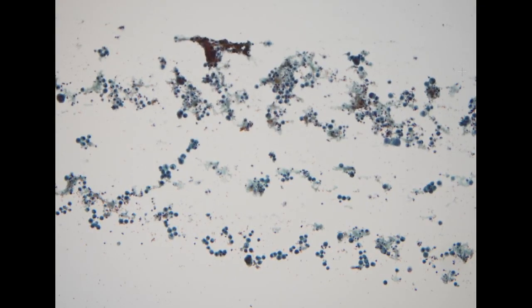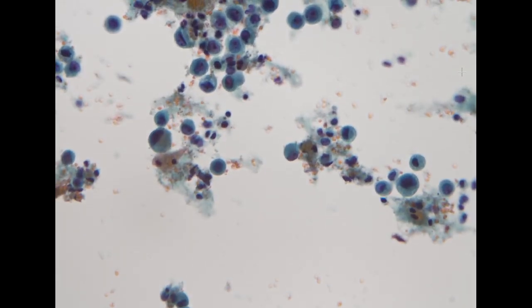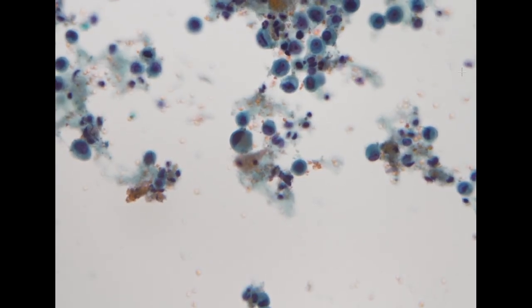So let's move to some body fluid. The first specimen is an ascites specimen. On low power, you can tell that the specimen is a little bit bloody. So we've seen some degenerated blood in the background, as well as a lot of these single cells. Some of the cells show eccentric nuclei and a little bit of material inside the cytoplasm that pushes the nucleus to the periphery of the cells.